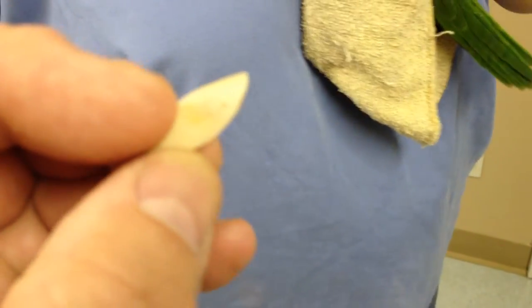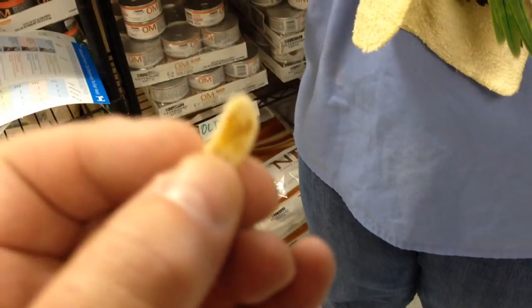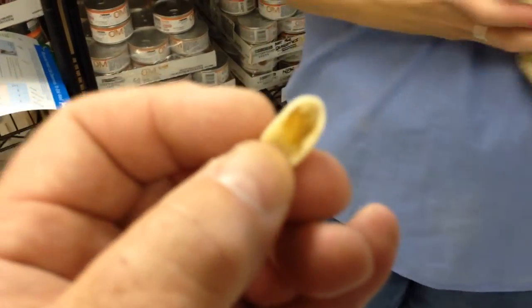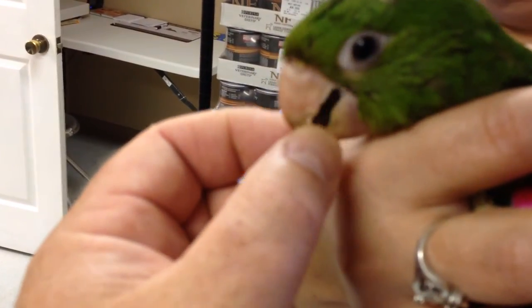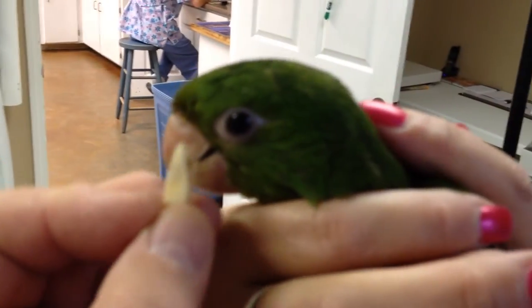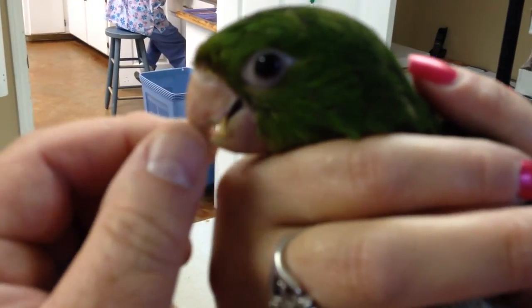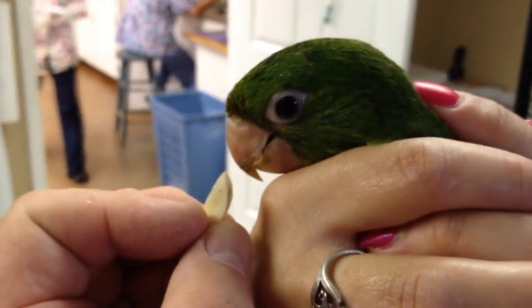This is not a pistachio seed. This is actually a fake beak, a prosthesis that belonged to this bird - for his prognathism, which means his lower beak was longer than his upper beak. What we did was put this little piece on his beak and trained his beak to actually go in normally, like you see there. Look, what a good bird. So that's that case - I'm going to go show him to Mom and see what we've done.